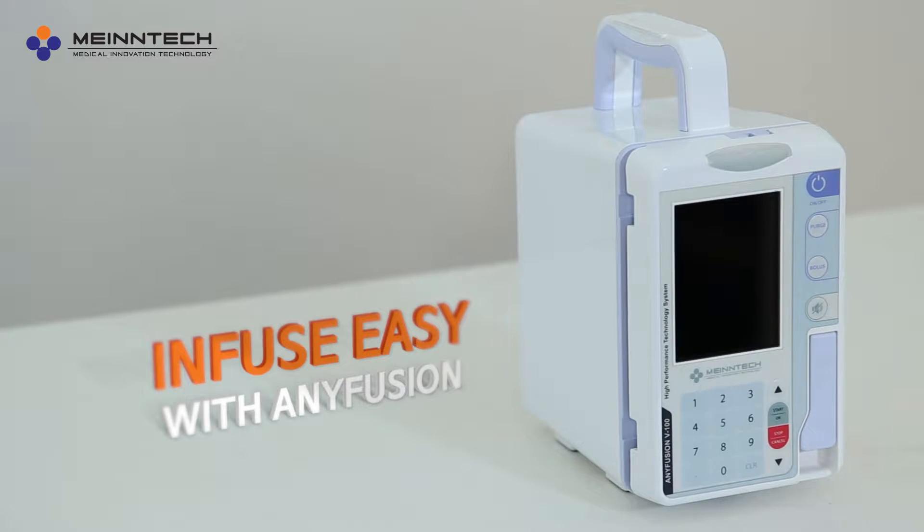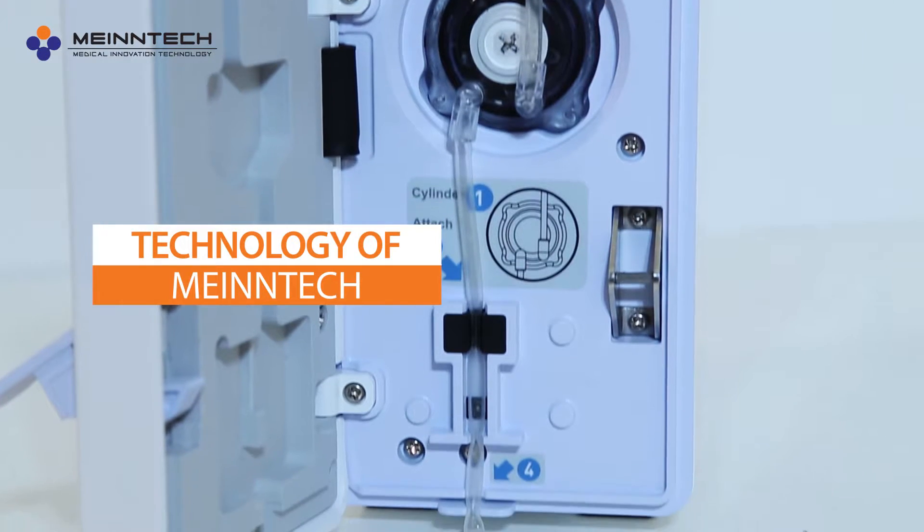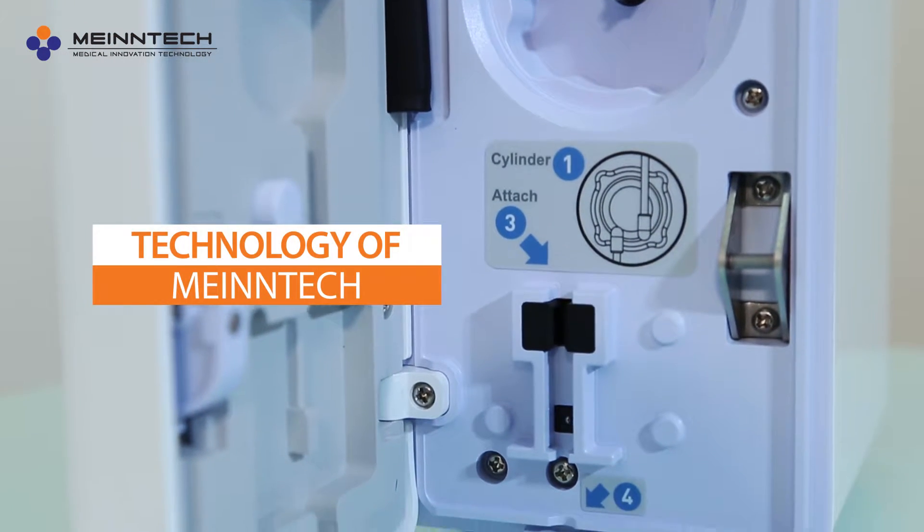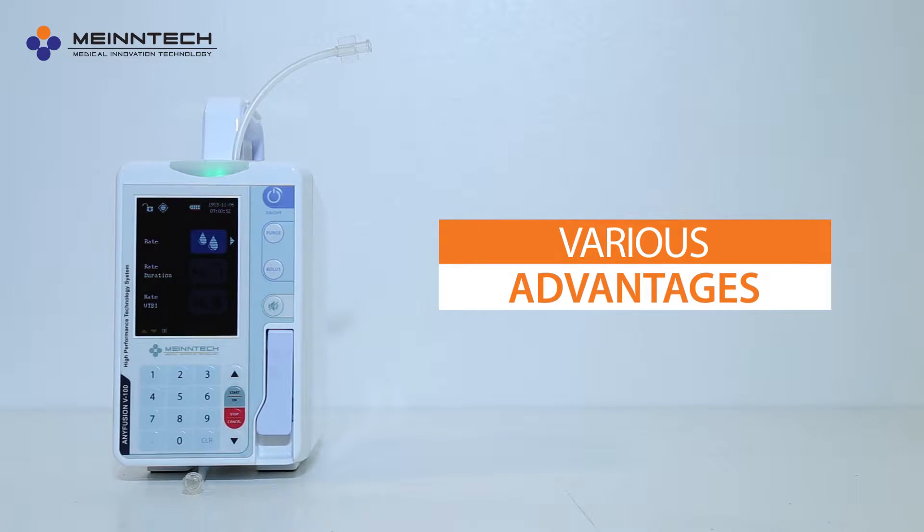Meinntech's Anyfusion — now infuse easy, anytime, anywhere with Anyfusion. The Anyfusion cylinder is the core technology of Meinntech, providing accurate infusion and various advantages.